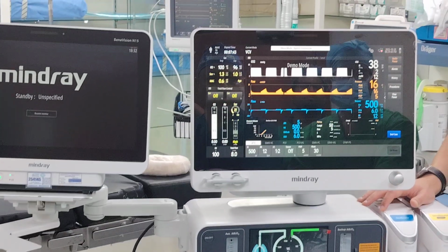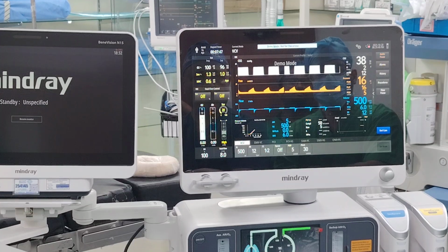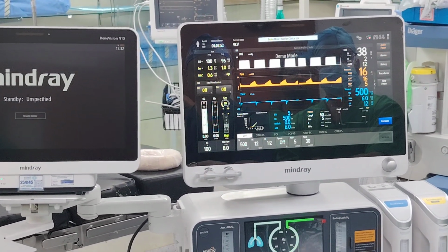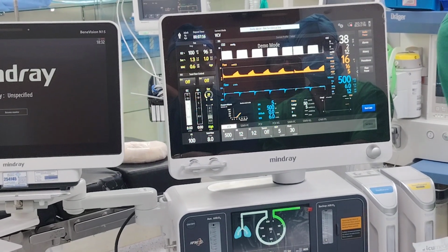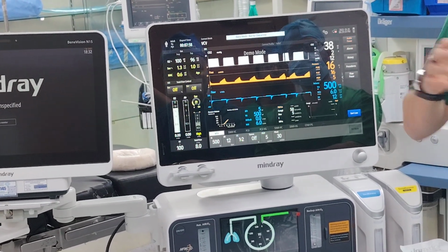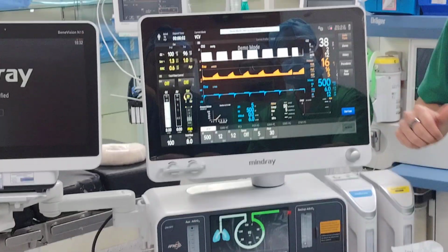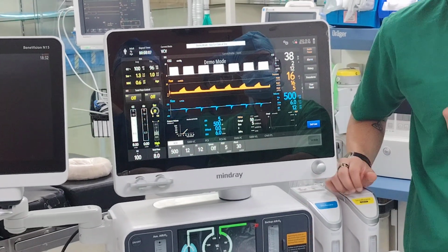Now the question would be, you tell me, Halit, if it's very high, what do I do? Two things. First, it depends how high it is and how long. Today, if I punch the wall 1 time, nothing will happen. I punch it 200 times, it will be something, yeah? Right? My hand will break or the wall will break, right? So long surgeries, actually, this is very important. This will show you if you need to open up the lungs or not. And when I say open up the lungs, I mean lung recruitment.